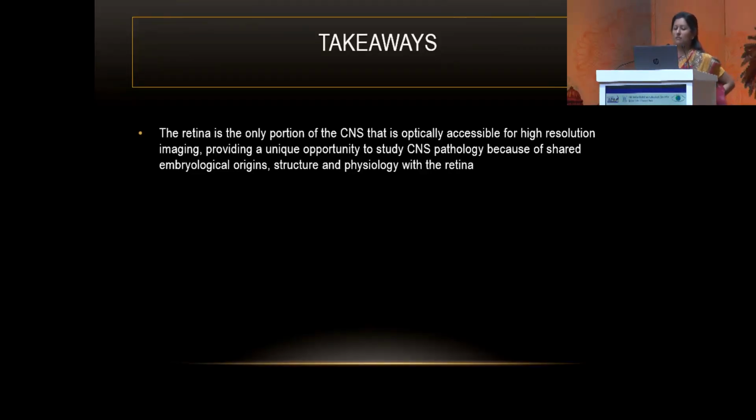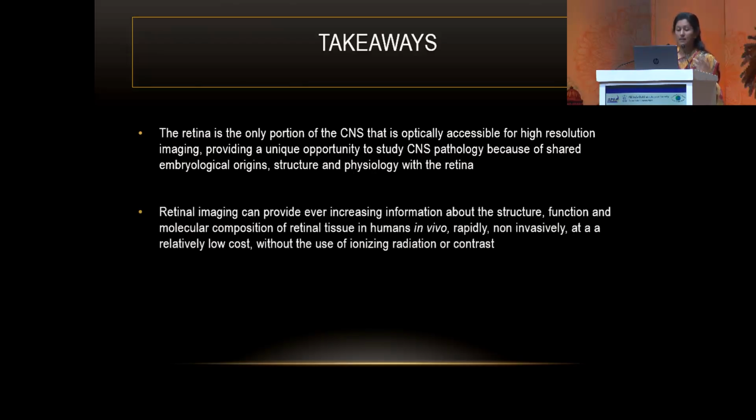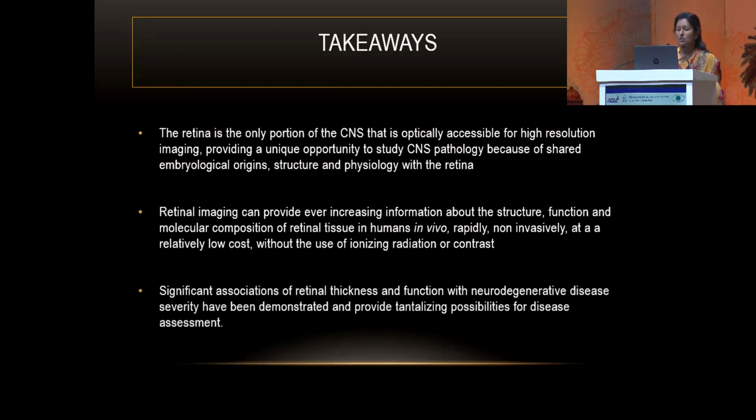So to take away, the retina is actually the only portion of the CNS which is optically accessible for high resolution imaging without the use of radiation, at a relatively low cost, and without the use of any contrast. So the association with neurodegenerative disease severity has been demonstrated, and these actually provide a lot of possibilities for disease assessment and even therapeutic interventions in the future.